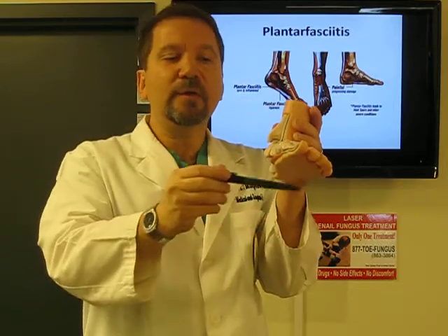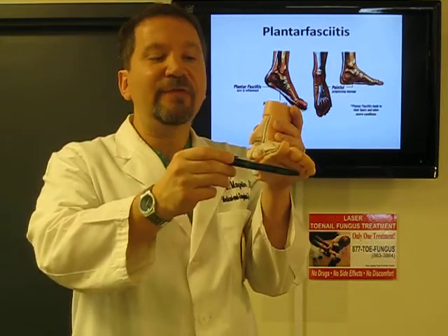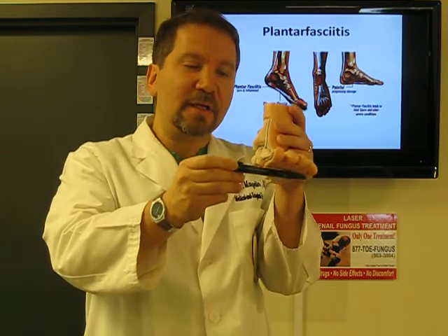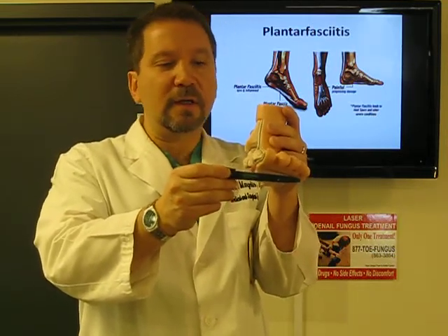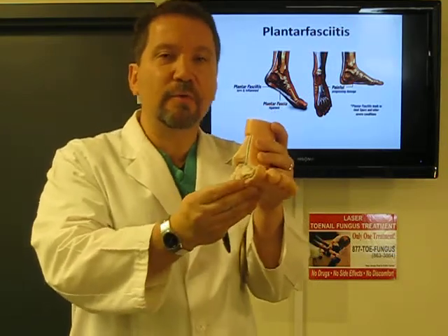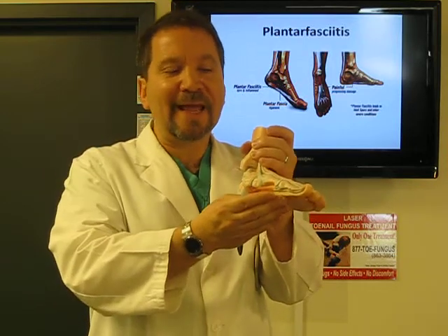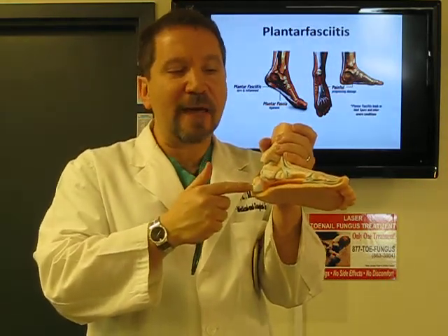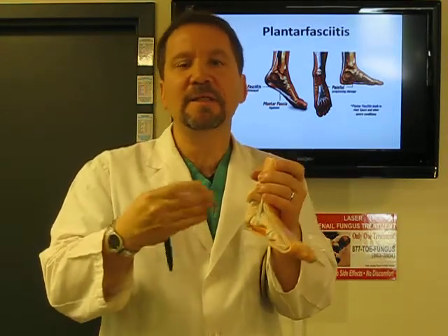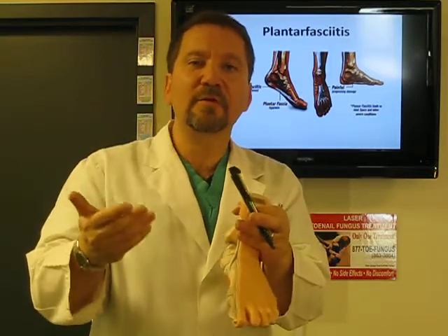With an orthotic, what we do is measure the angle of the front of the foot to the back of the foot and fill that in. That filling in of that angle eliminates a lot of that twisting or the tearing or the torsion of the foot as it comes over. It actually supports it. So it doesn't just support the arch like an arch support would. It actually addresses the angle of the back to the front of the foot that is different for each person. It is customized. It is really the difference between wearing custom eyeglasses or eyeglasses off the shelf.